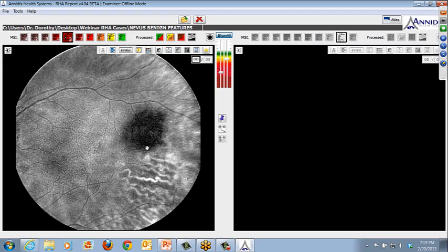And in this particular case, all of the principles of following a lesion still apply. The lesion is evenly pigmented. It has even borders. You will notice with multispectral imaging, some of these borders don't look as perfectly smooth as they would on a traditional view or on traditional fundus photography with a variety of filters.